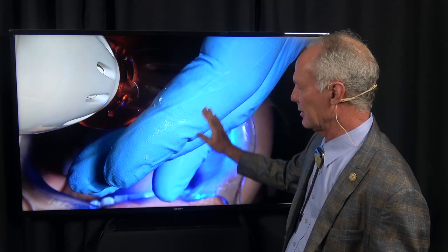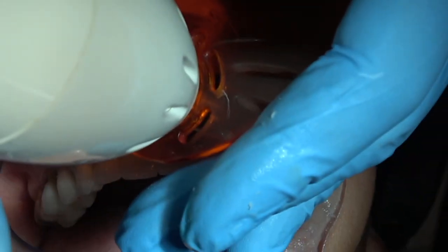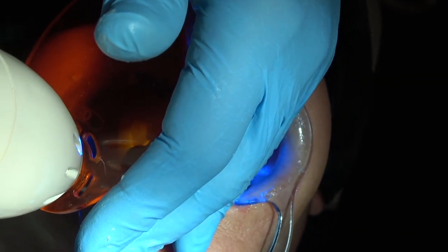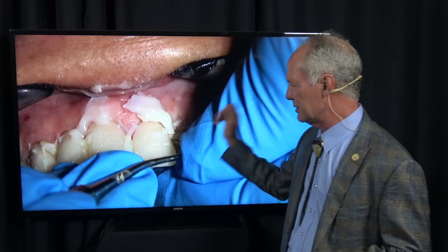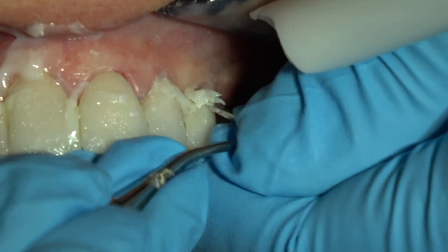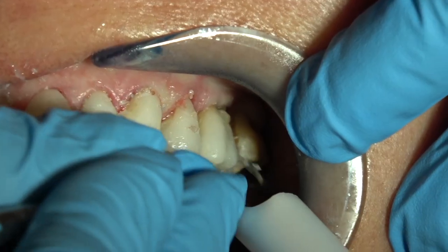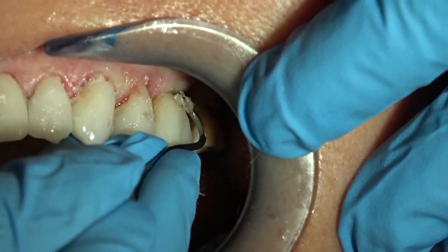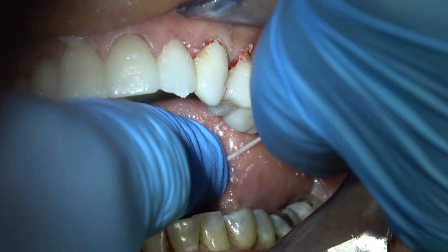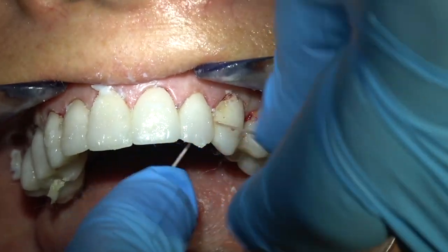You want to scrape the excess off so that micro gap between veneer and tooth is like a sandwich - completely filled with luting composite. Once you've got everything seated perfectly, take your curing light and go a thousand-and-one on the facial - just that quick. Then go to the palatal and do the same thing, a thousand-and-one. See how hard that cement is with just that initial set - it's kind of like crunchy snow. Take the back edge of your scaler and just peel this off. When it peels off like this, the micro gap is filled.